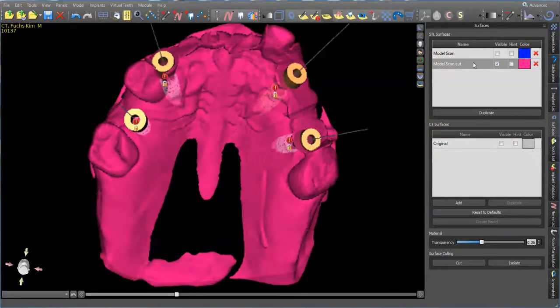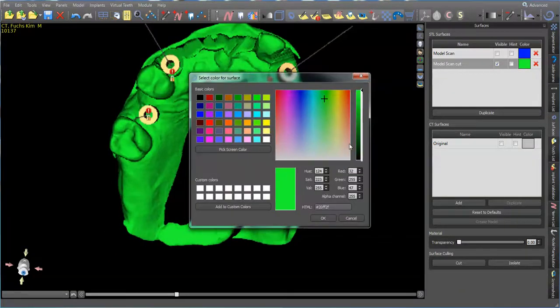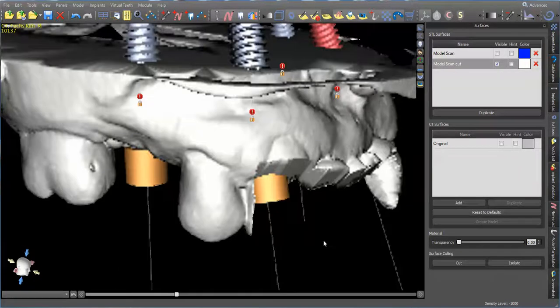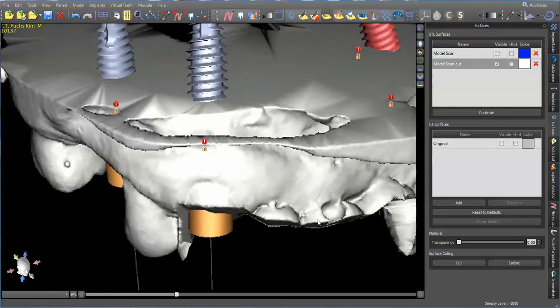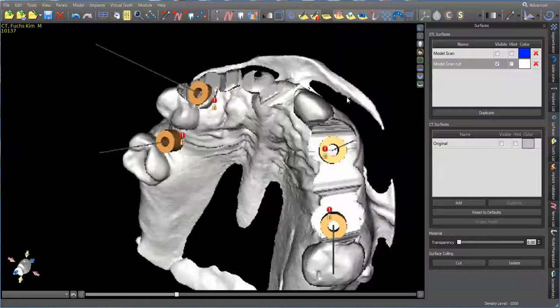And all I have to do is, I'm really not liking this color. I'm going to change this color again. It's a little harsh. All right. All I need to do now is, and you can kind of see it a little bit better here, you don't want to have to take everything off. You can be a little bit better about removing this, but it's not a big deal. As long as it has good hard stops on the teeth, that's the biggest concern.